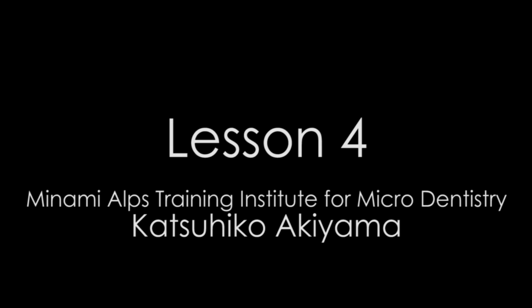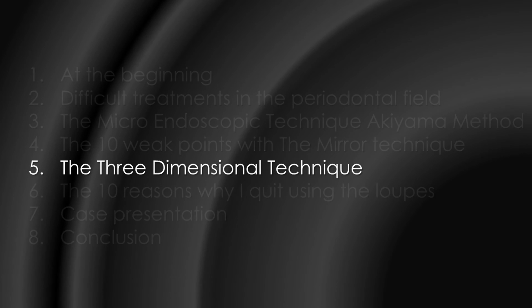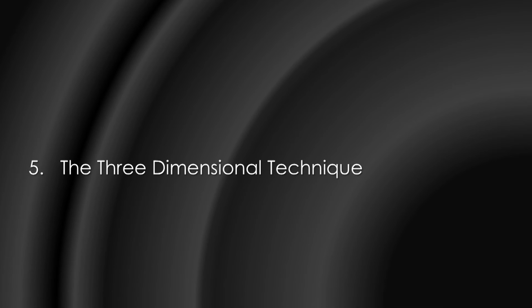Lesson 4. Number 5: The three-dimensional technique.